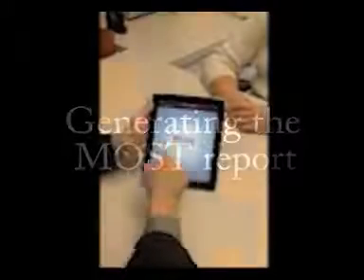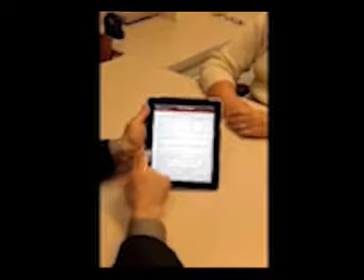When you get the report, you're going to see that it gives you the information regarding the current score, in this case 18, and its comparison with the previous mini-mental corrected as a MOST equivalent, which is also an 18. Our report tells us that a change in cognition has not occurred since the last time this person was tested. The second thing we're going to see here is a conclusion that at this score, this patient has achieved a score in the range of mild dementia.